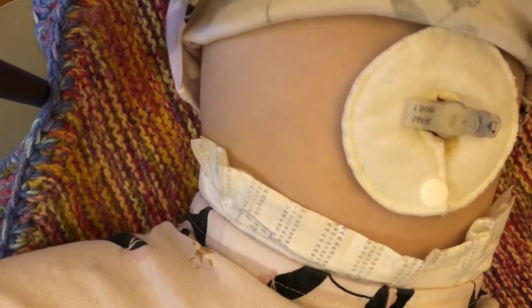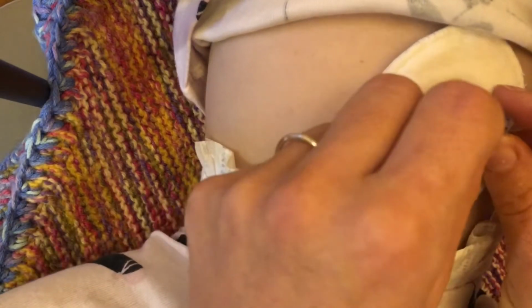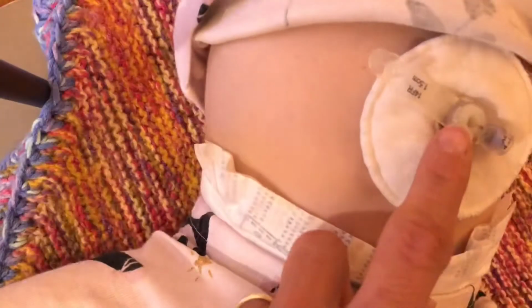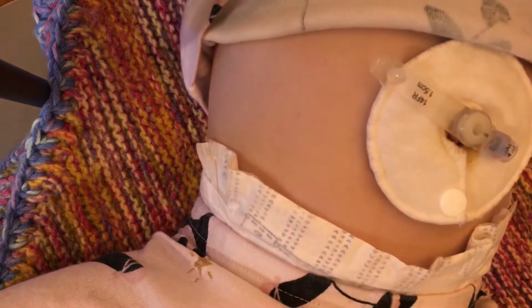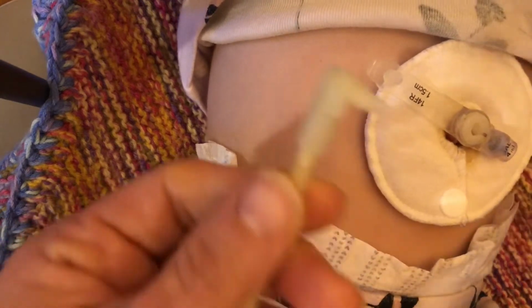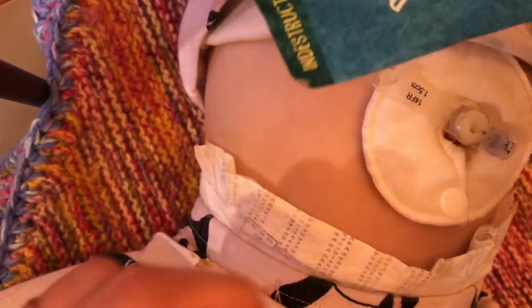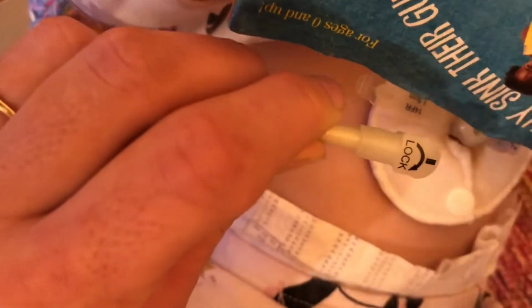There you go. So to hook her up to the feeding tube, what you're going to do is open up this little flap. You just pull it open, okay? Oops, Patricia. And so now it's open. Nothing's going to just come pouring out, because there's a little piece in there that holds it. But here's her tube. And so what you do is you line up this line with the line that you see right here. And then you turn it in the direction of the arrow to lock it.